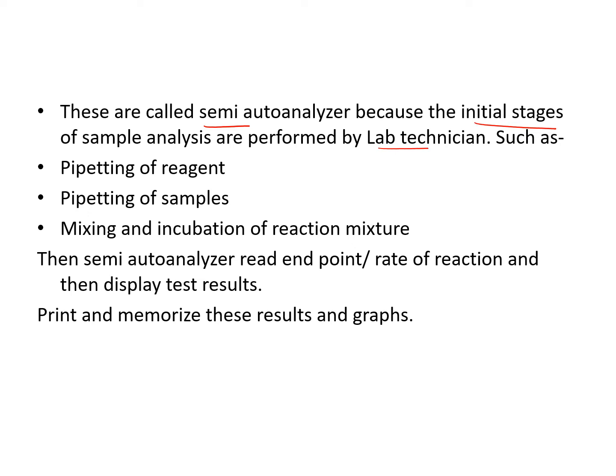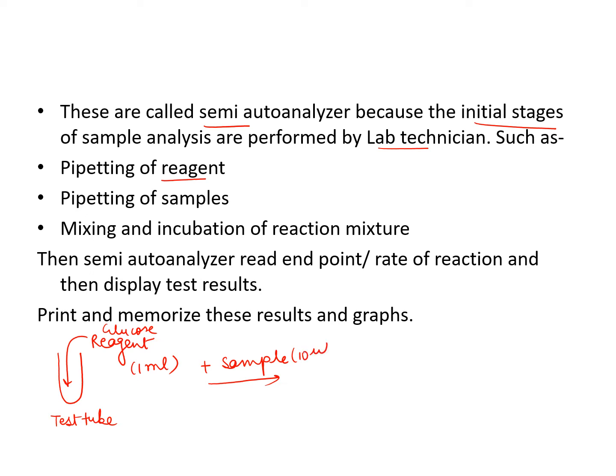What are those stages? Like pipetting of reagent. See, if I want to analyze sugar, what are my steps? Like I will take a test tube. Okay, this is the test tube. I will take reagent in it, glucose reagent. Okay, like 1 ml I am taking of the glucose reagent. Then what will I do? I will add the sample. Like 10 microliter I am adding of the sugar sample, or patient sample, sorry.